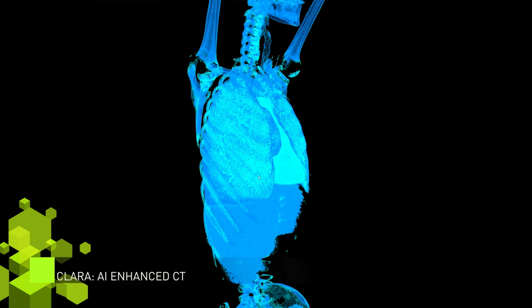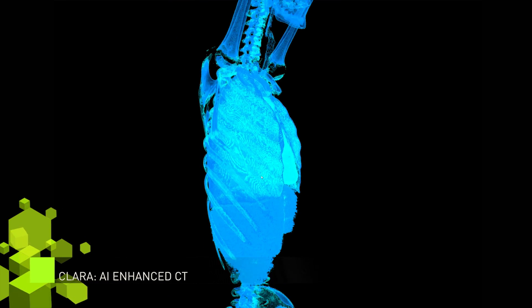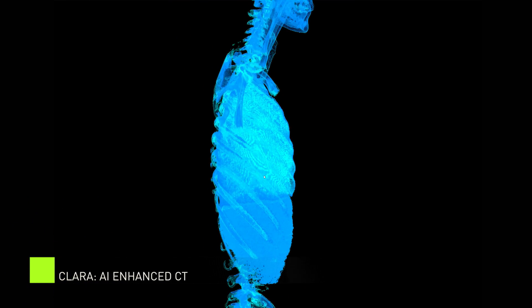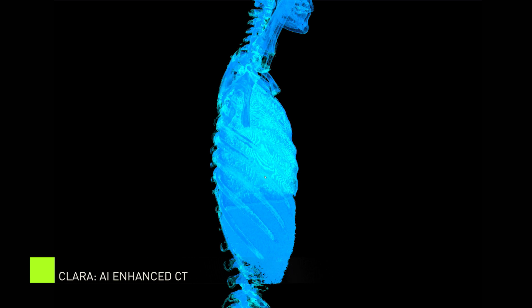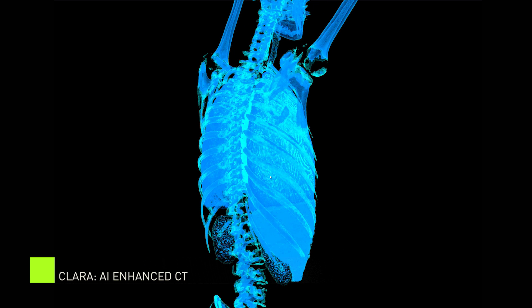Cinematic rendering is changing the way radiologists go about their work and how they view a patient's body. By augmenting existing radiology techniques with artificial intelligence and deep learning, we are enabling a whole new way of looking at and working with medical images.